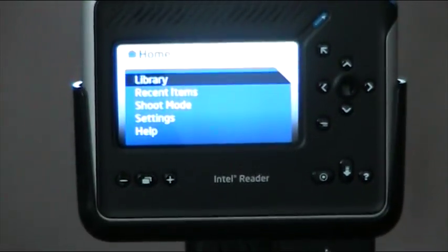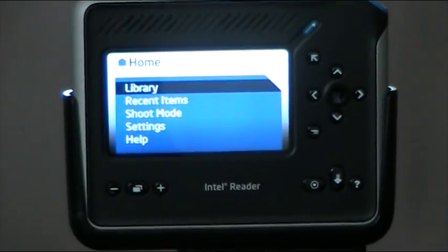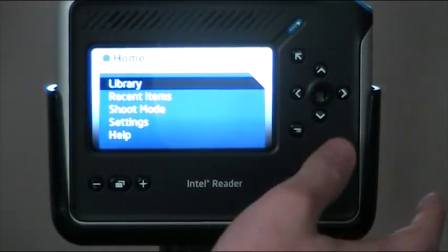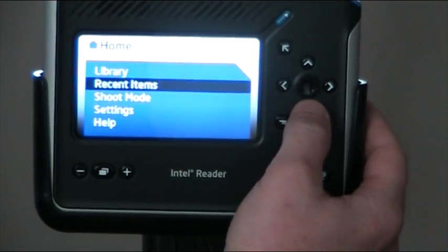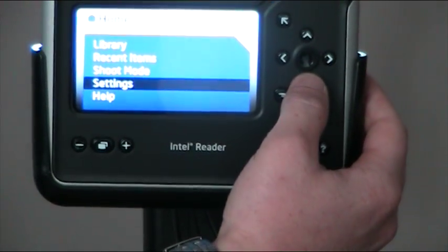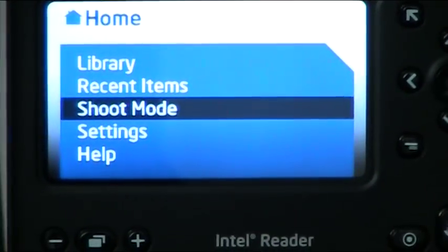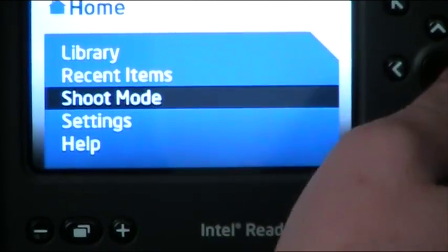So we have the Intel Reader — it's now on and ready to go. The home menu has speech output, recent items, shoot mode, settings, and help. For speed, what we're going to do is just go right into shoot mode. We're not going to go into the settings. Obviously, you can turn the sound off if you want.